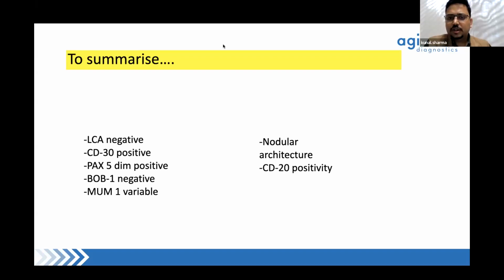You're right, Dr. Arun. Extensive CD20 positivity becomes a ground for giving rituximab to these patients, and they respond much better with that. Somebody has written OCT2 is also positive, correct? We can see one of the transcription factors positive, either OCT2 or BOB1, but usually one is lost in classical Hodgkin's lymphoma, whereas in NLPHL you will see both of them positive.